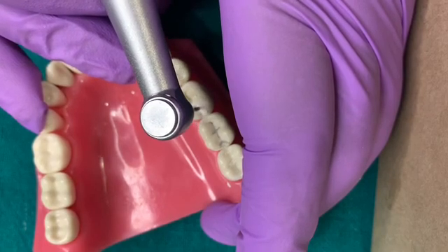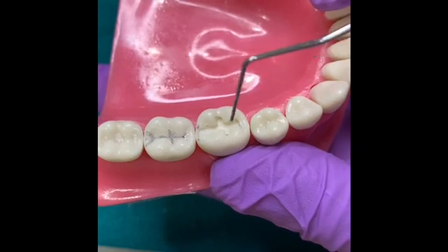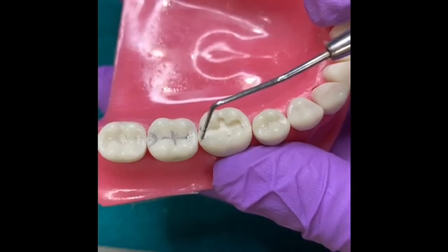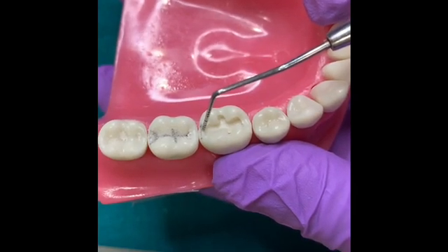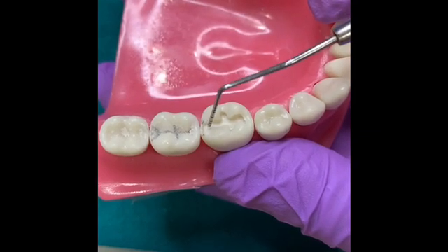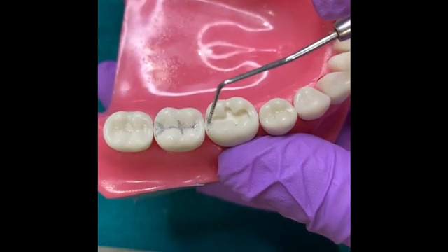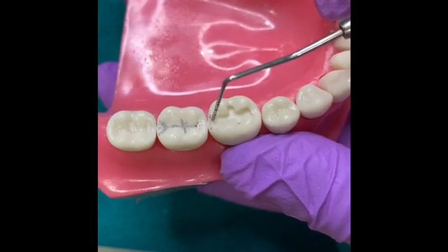Now this is the shape that we have attained so far. On the buccal side we have extended in this manner, and on the lingual side it is almost straight — this is the kind of shape I really wanted, and I have a thin layer of enamel here. At this point, I will start making a proximal ditch — that means I will move my bur from buccal to the lingual side just here and make a well or a ditch in this area.